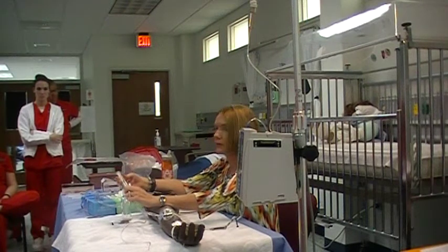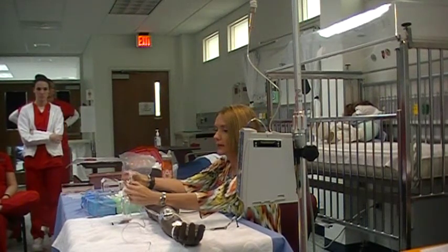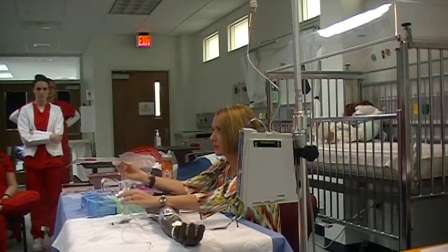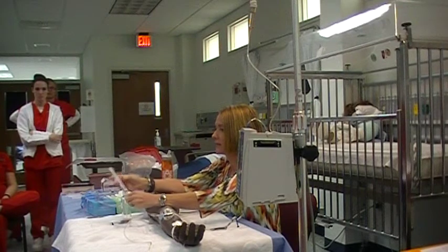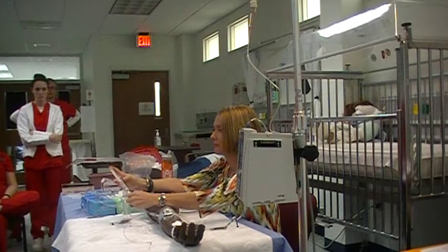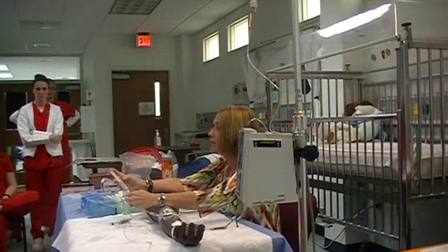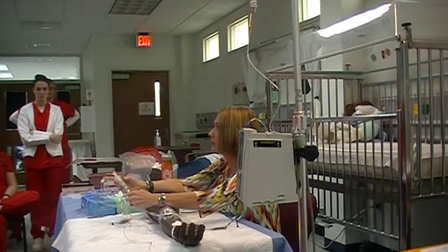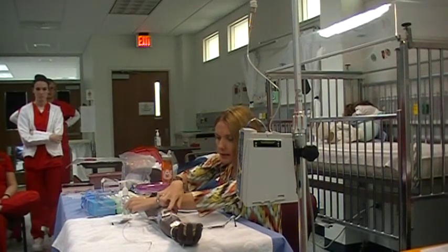Okay, now how can we do this? We've stopped our pump. We're going to take this out. Now when I say flush to see if something is patent, I don't mean that we push it like this. Because are we really going to see anything happen? It's probably going into the interstitial fluid. But if you push like this, we're going to see that welt come up underneath the skin, and you can kind of do like this.